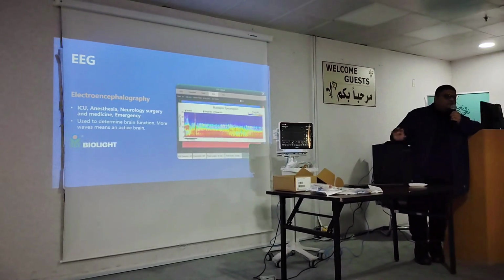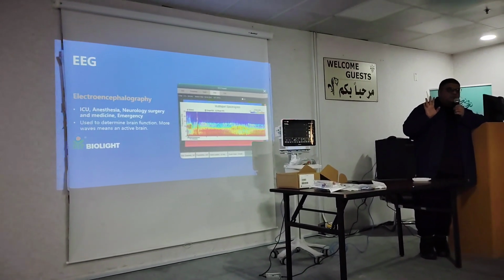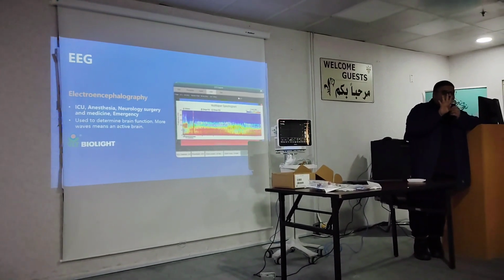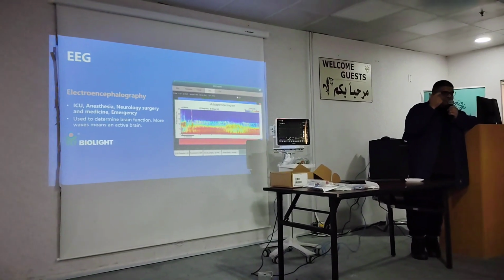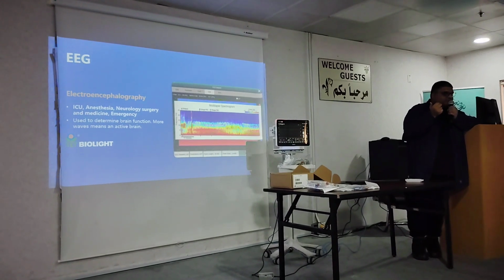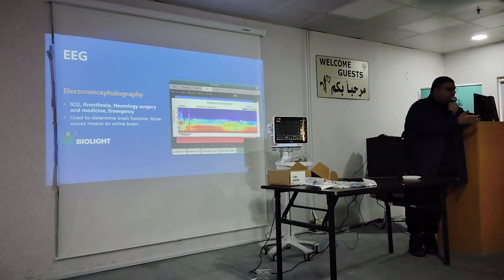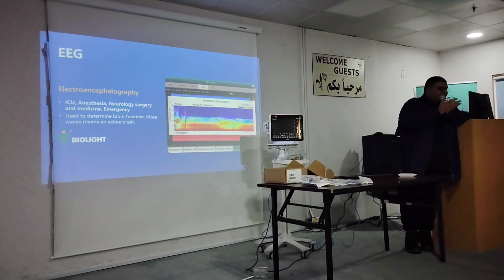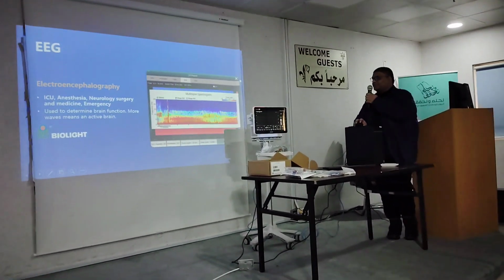Okay, first you need to know the waveforms. So maybe you need to know the 4 frequencies. There are 5, but you need to know 4. You know alpha waves? Beta waves? Delta waves? Gamma waves? What else? Alpha, beta, gamma, and then? No, we don't have omega waves. I wish we did. Okay, anyways.